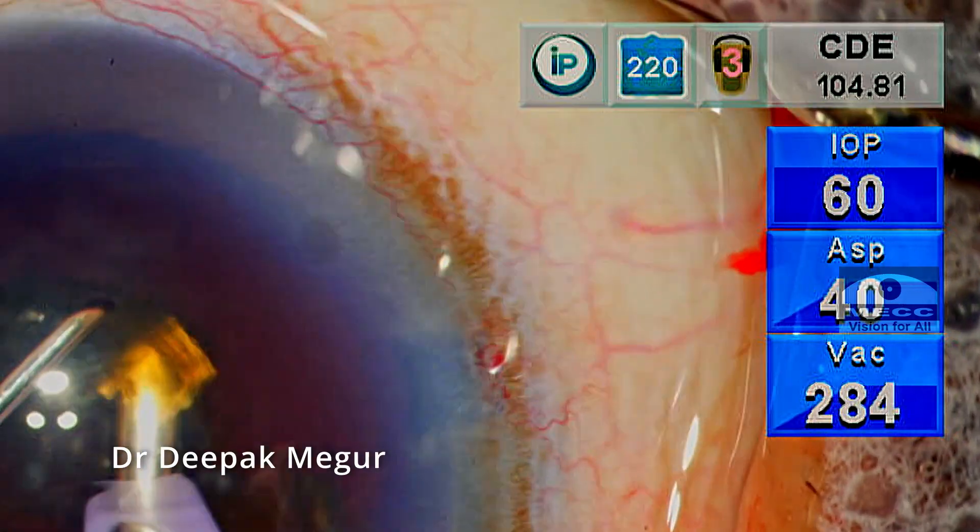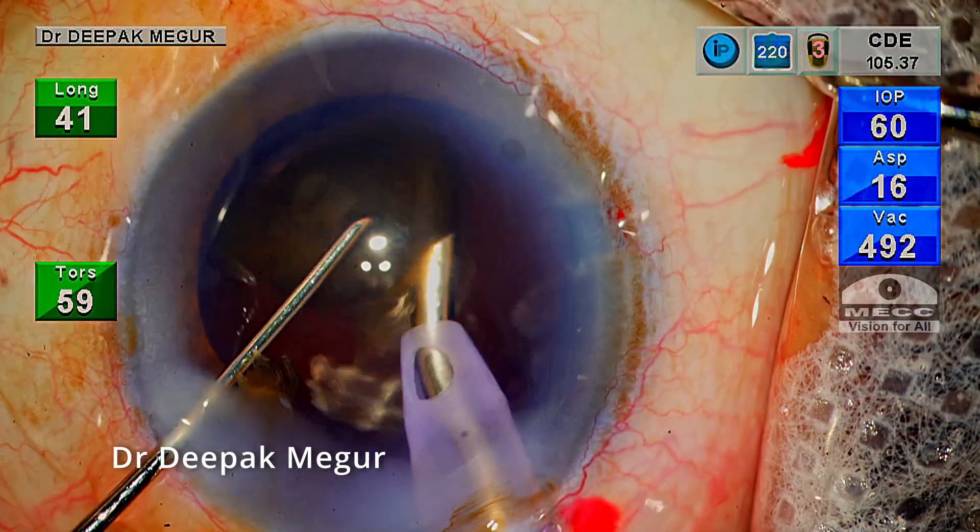There's a belief that an excessive amount of phaco energy consumed during surgery is going to cause endothelial damage. Does it really? Let's find out.